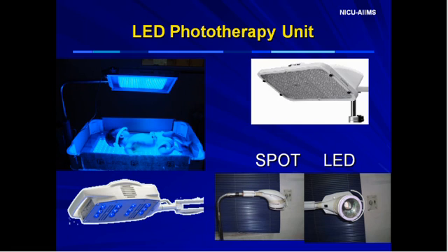Expected shelf life of the LEDs is about 10,000 to 50,000 hours, which decreases the running cost. Electrical energy is converted to light energy more efficiently in LEDs than standard light devices, and thus greater efficiency is possible. Hence, they also produce less heat. In addition, since they have very low power consumption, they can be used in peripheral health setup. Moreover, LEDs project light toward the target. In vitro and in vivo experimentations have established that the efficacy of this light source is a match for the most intense halogen or fluorescent tubes.